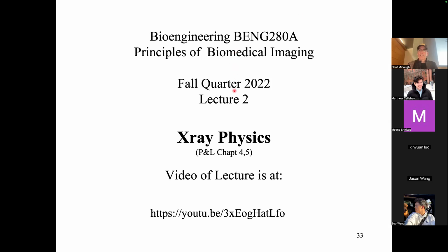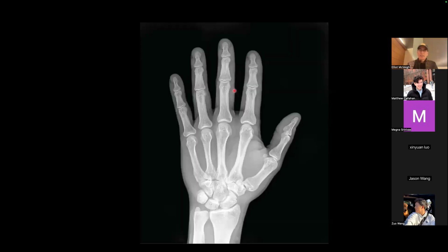So we're now going to move into X-ray physics. This is a big jump in topic. Here's an X-ray image. It's a transmission X-ray image of somebody's hand. They just put it on top of a film screen detector or a digital X-ray detector, shined X-rays through, took a picture. And you can see extraordinary detail in bones and everything like that. That's why this is used a lot in orthopedics, and it's used for mammography because you can produce these super high resolution pictures. If you've got your object right on the detector and you shoot X-rays through it, you get really high resolution pictures.